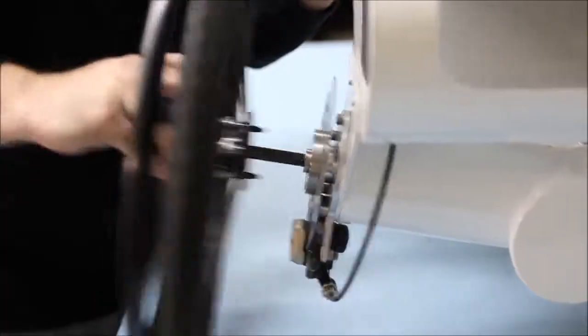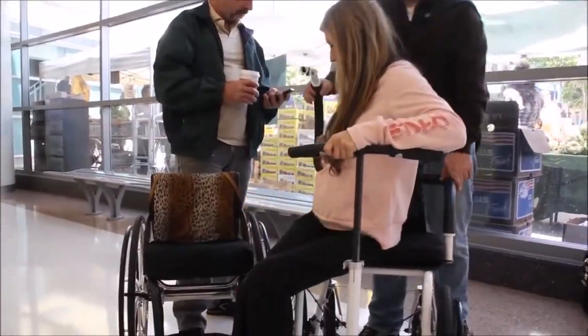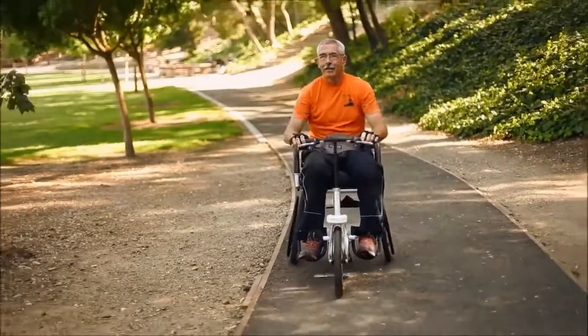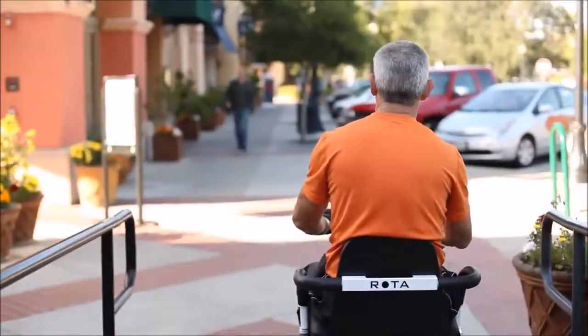So what we've addressed is two things. First of all, we can use much smaller road wheels. The importance of that is that the rider, when transferring, can do so laterally. They don't have to get over the wheel because it's under the seat. But it also allows us to use bicycle-style steering, which means that instead of having to push very hard on one side or the other, you can just steer and you don't even notice the effects.